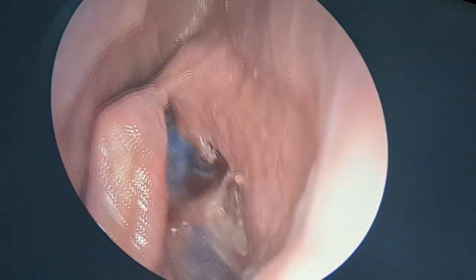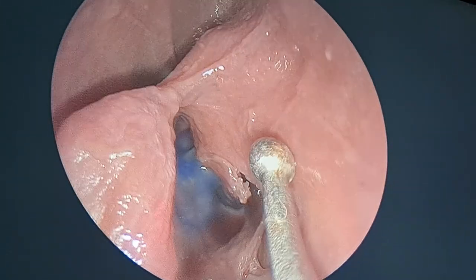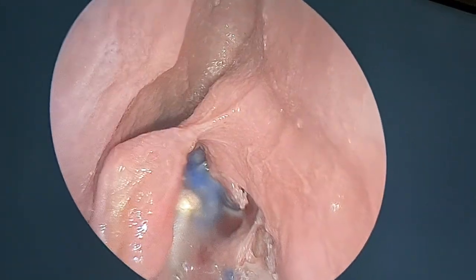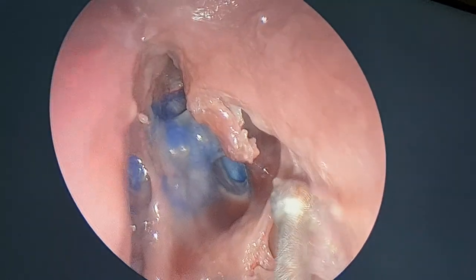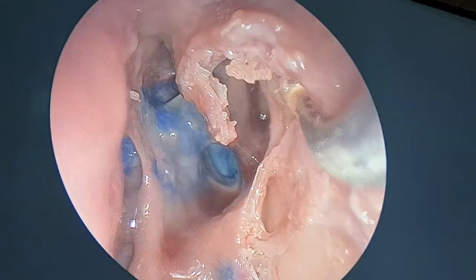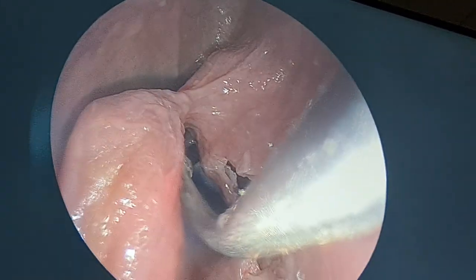Now, what is the advantage of the 45 degree telescope over here? I told you, for the frontal sinus you need to see only three things. One, the medial limit, that is your turbinate, keep the turbinate in view. Lateral limit, keep your lamina in view. The reason being, while dissecting for the frontal sinus, we are not supposed to transgress the lateral as well as the medial limit.